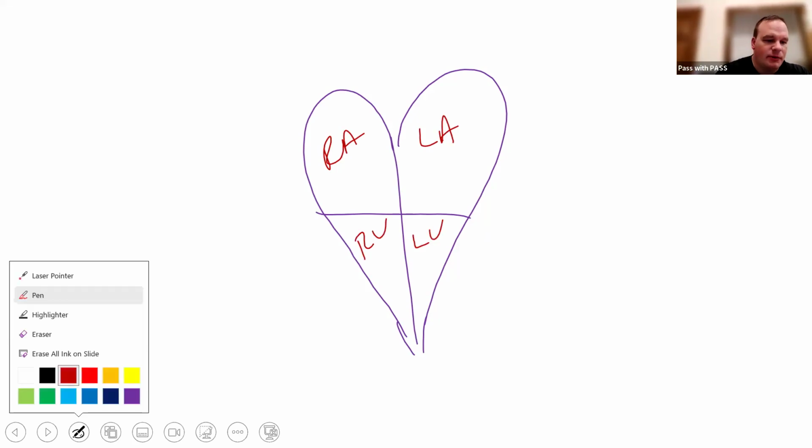So remember with AFib, we have a fibrillatory waveform. We have indiscernible P waves. The reason why is my atria are fibrillating, just like in ventricular fibrillation, where my ventricles are fibrillating, right? And I get that wide, chaotic waveform on the monitor, which we'll talk about in 2 weeks. With atrial fibrillation, my atria are largely doing the same thing. It's just not as detrimental to the patient because my ventricles are still working the way they should.